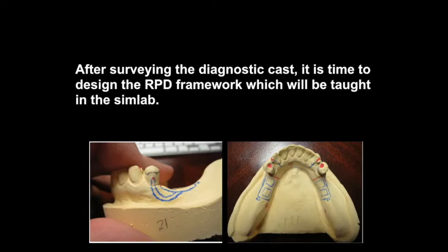So after that, you already finished all the steps to do the diagnostic cast surveying. Then it will be time to design the RPD framework, and we will discuss that in the sim lab.